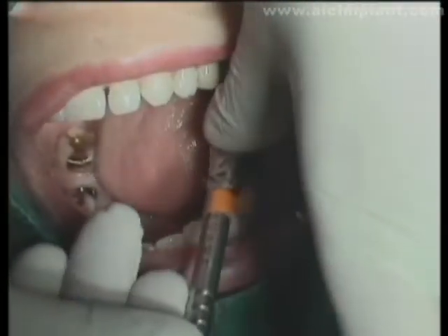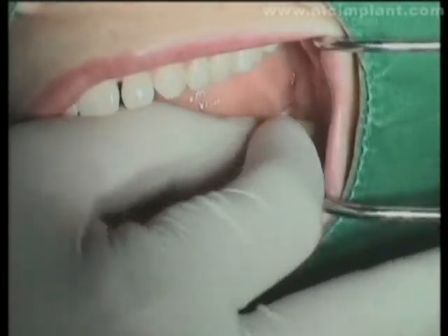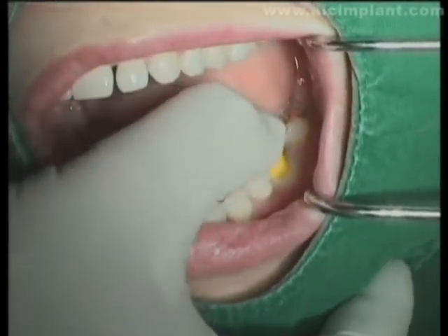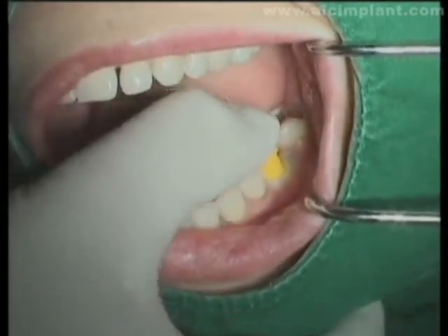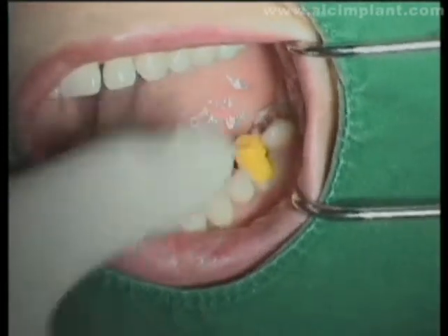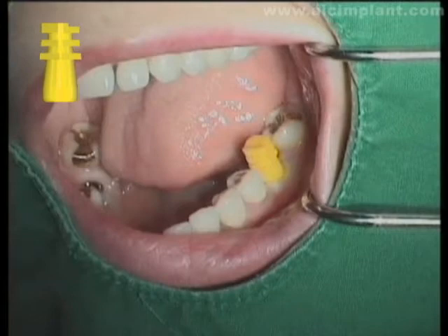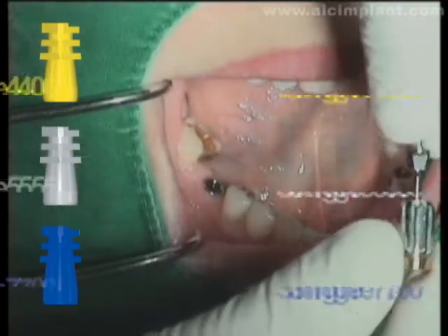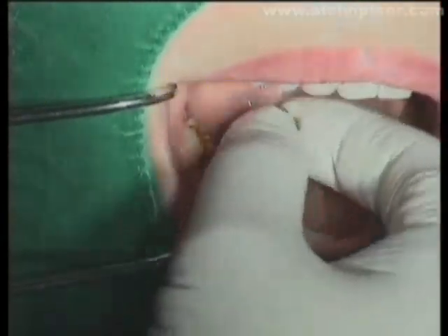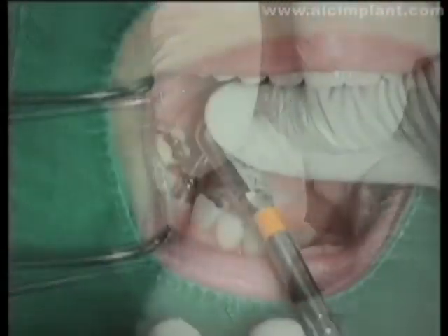Afterward, tighten to a final torque of 30 Newton centimeters using a torque wrench. Next, select an impression coping and take an impression. The impression copings for rigid abutments are made of plastic, like this. They are also color-coded according to height. For example, the impression coping for a height of 4 millimeters is yellow, that for a height of 5.5 millimeters is gray, and that for a height of 7 millimeters is blue. The diameter is differentiated as 4.0 millimeters, 4.5 millimeters, and 5.0 millimeters.